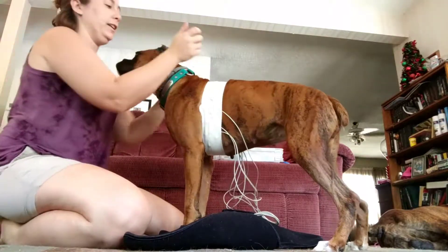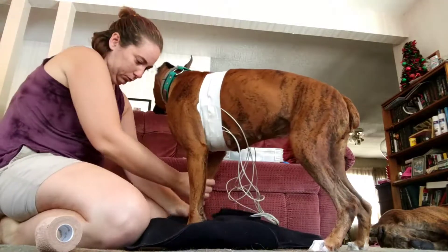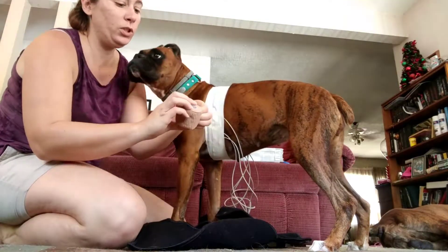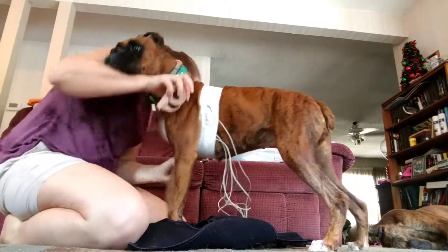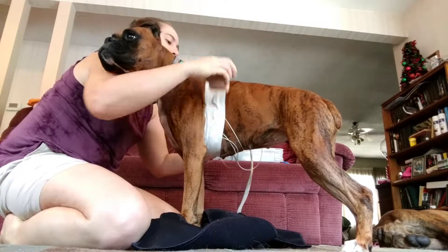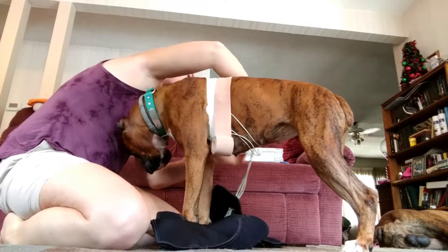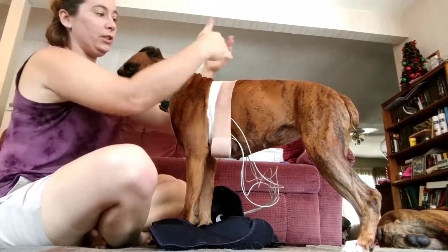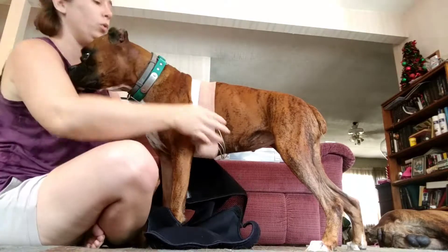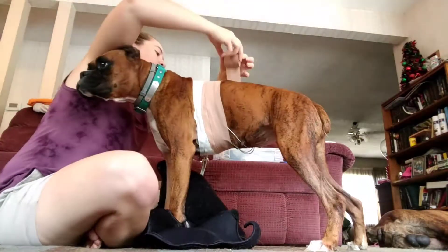After you get that done, there's still excess wire down here. You can take the sports tape and try to put the wires as much up to their back as possible. Typically the wires lay across the back, but on this one I didn't do that, so I'll pull the wire up and then run the sports tape around the wires.